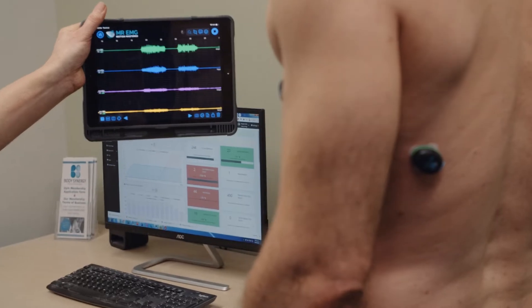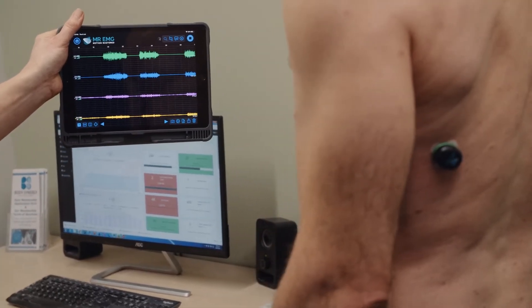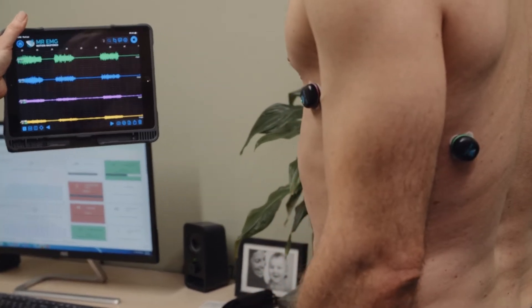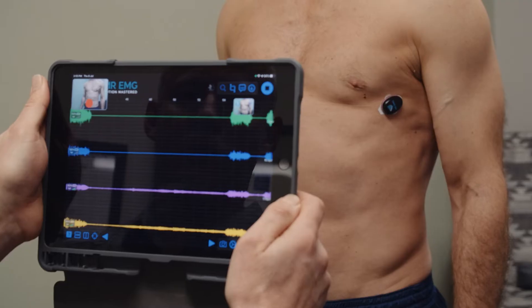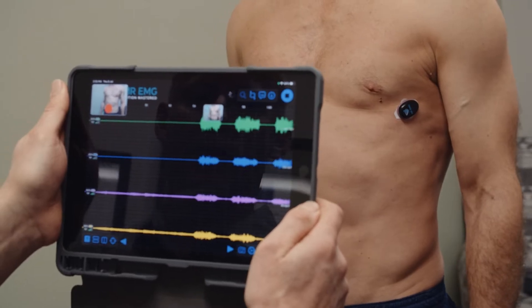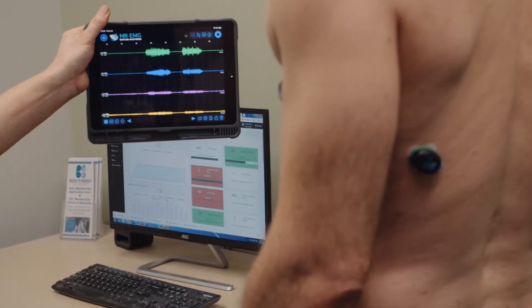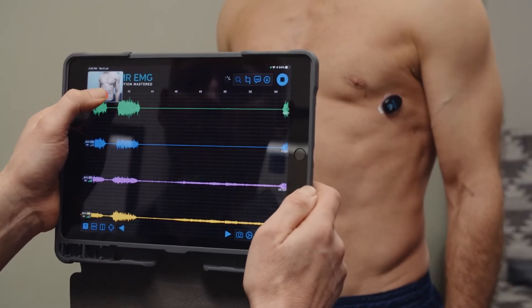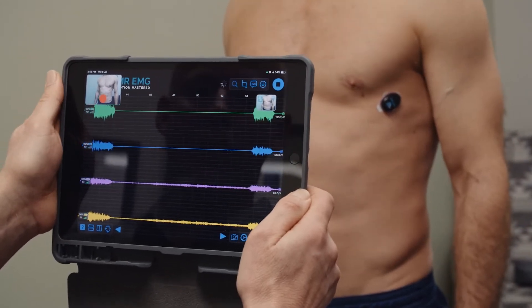Show them how to perform a maximal voluntary contraction of the latissimus dorsi muscles by standing tall and squeezing their shoulders down using Mr. EMG biofeedback. Now record your subject performing three maximal voluntary contractions of the latissimus dorsi muscles simultaneously. Ensure you take a picture of each activity so you have an image to match your data.